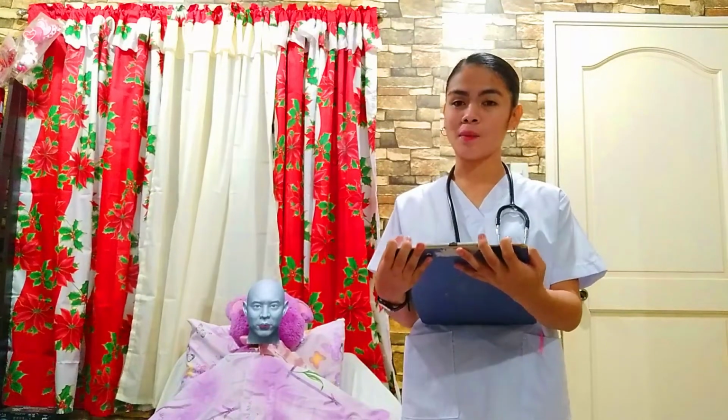So first, what is the purpose of suctioning? Suctioning clears mucus from the tracheostomy tube, and it is essential for proper breathing. When is the right time to do suctioning? We need to do suctioning to remove mucus or saliva from the back of the throat if the patient or the client cannot cough or swallow. So let's start with the return demonstration.